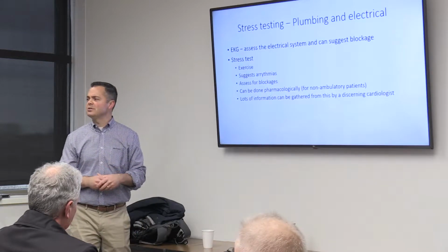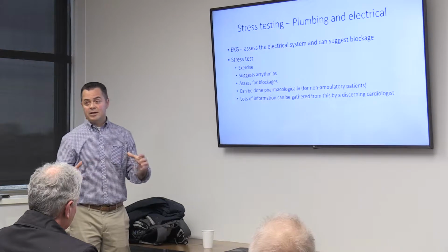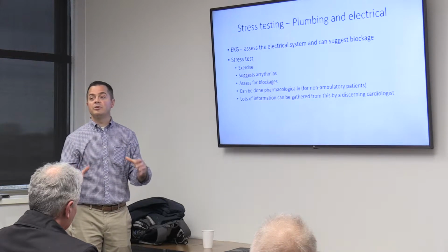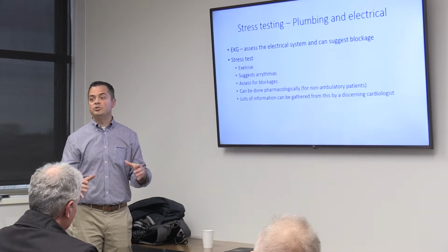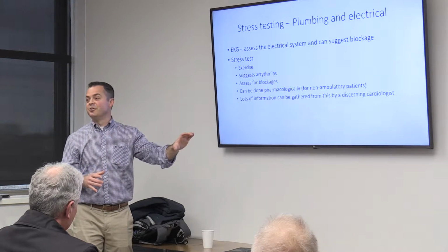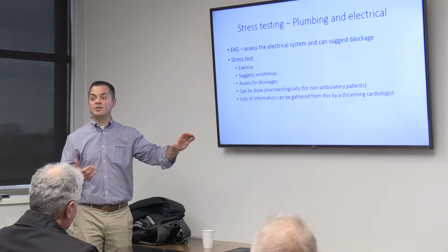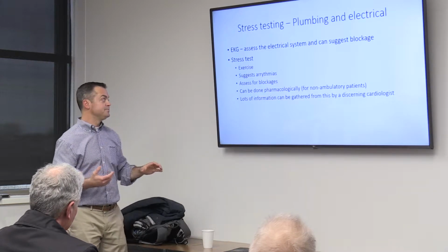Any other questions about stress tests? Okay. Great test. Just getting on a treadmill is a great test, and it's incredibly cheap. We don't have to go through any prior auths for your insurance to get a plain treadmill. They don't care. Doesn't cost that much, but it's very useful.